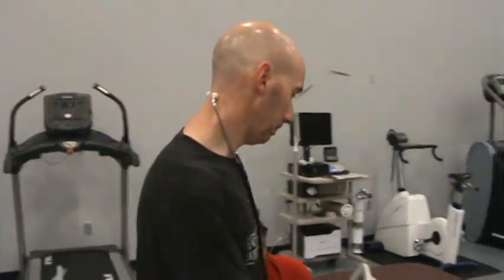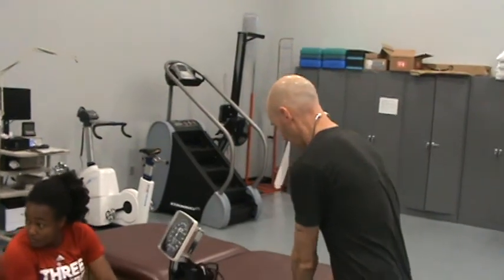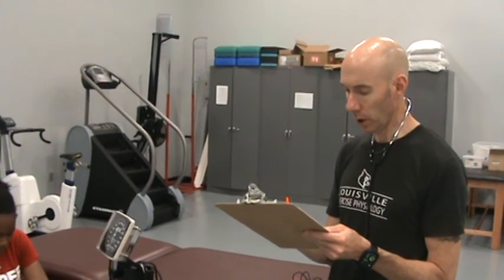So that time I got 108 over 62. So systolic was a little bit lower, diastolic was a little bit higher. Her blood pressure is still, you know, very easy to hear. You're gonna be in a situation where some people are gonna have loud blood pressures, others are gonna have more quiet ones. It's kind of just based upon a lot of factors regarding the individual. Somebody who's very much physically active, usually their blood pressure is gonna be easier to hear than somebody who is sedentary or has a lot of excess body fat, etc.